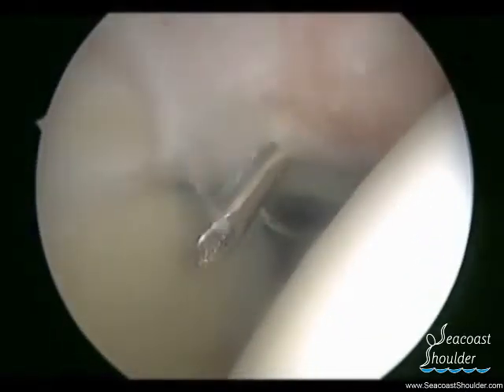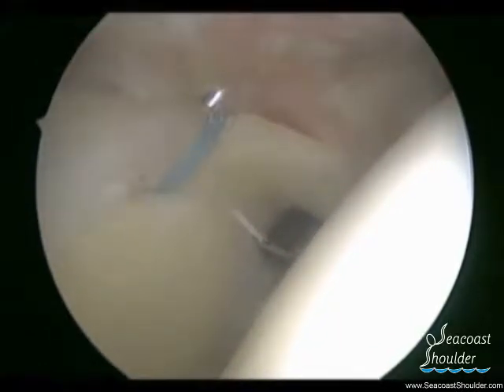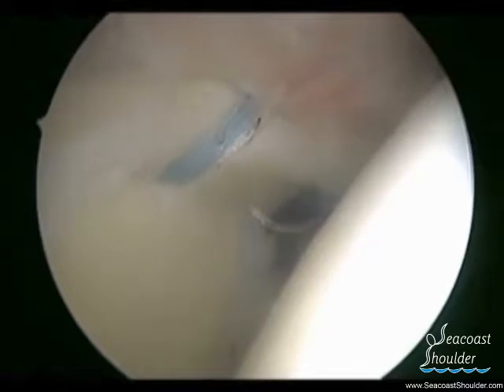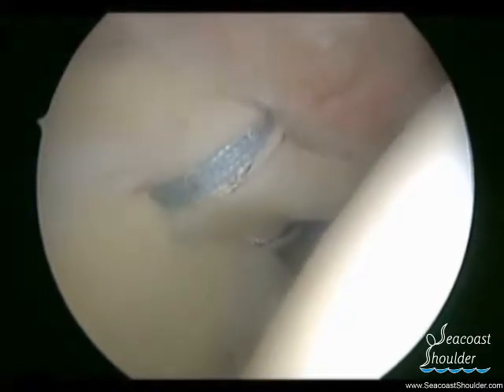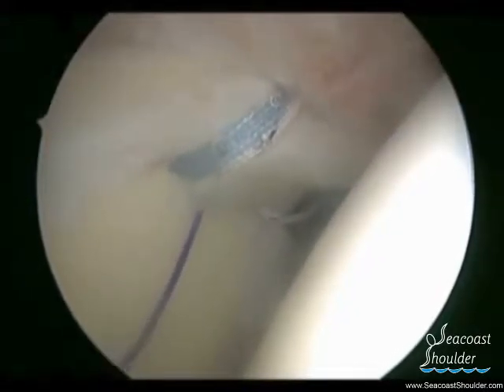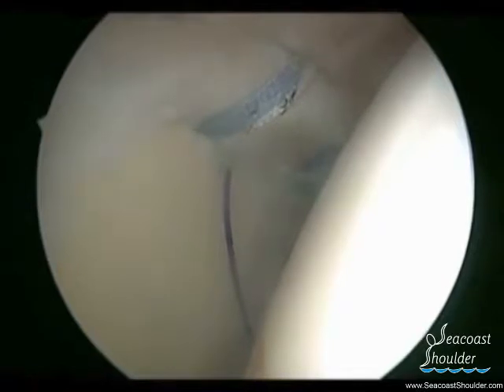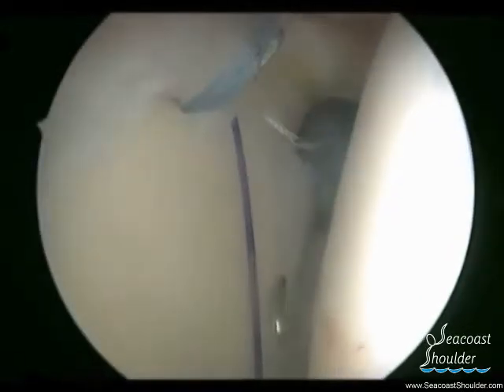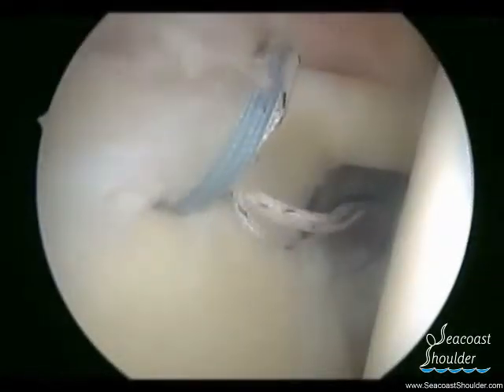A penetrating device is used to pierce through the superior labrum and pass a blue monofilament suture. This suture is quite weak and absorbable, and we will exchange it with one of the strong braided sutures that are attached to the anchor. A five millimeter clear cannula can be seen in the front of the shoulder, and a crochet hook will be brought through that cannula to grab the blue suture, which is used to shuttle the braided suture through the labrum.